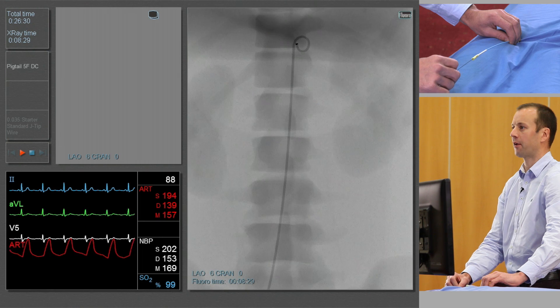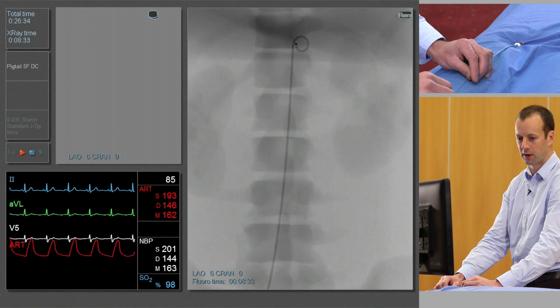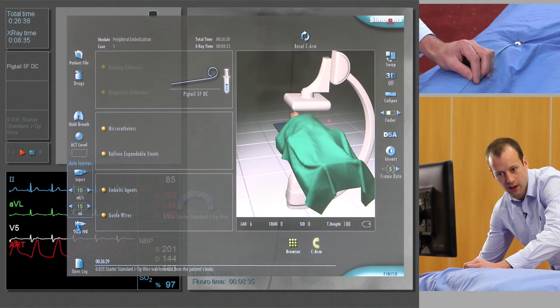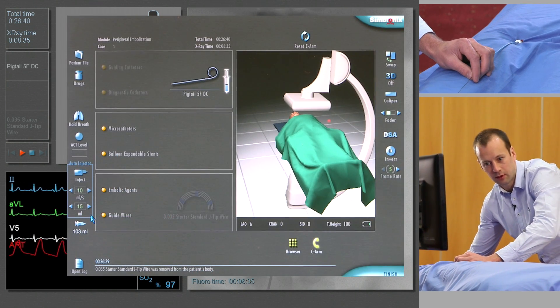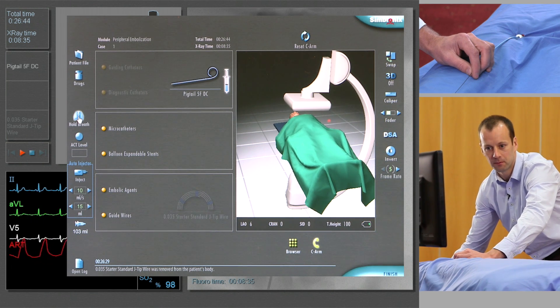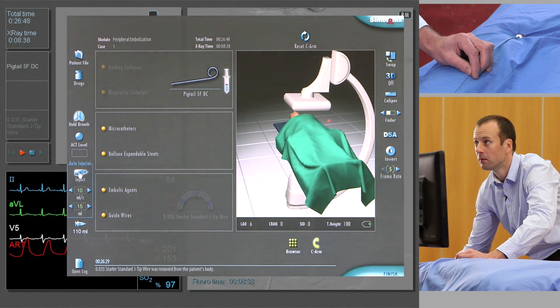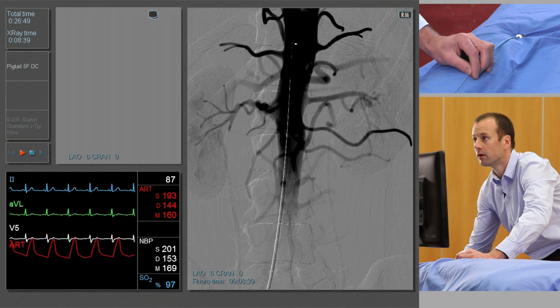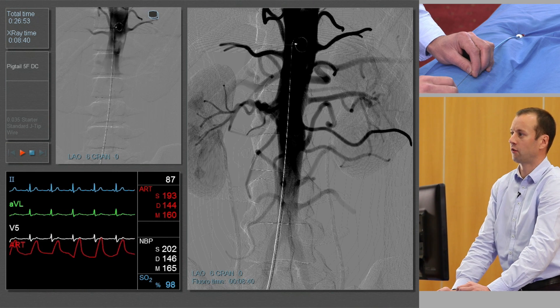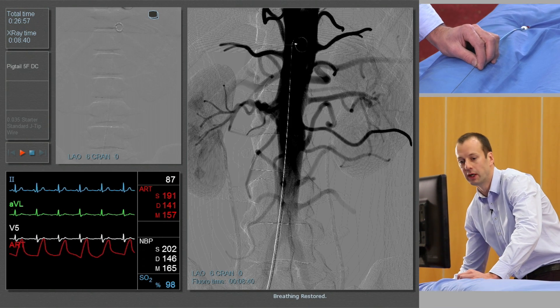We'll place the tip of the catheter at about T12 level, remove the guide wire, and we'll do a subtracted angiogram at 15 mils at 10 mils a second with a breath hold. Lovely. And we can see a clear view of the celiac and the superior mesenteric arteries, along with the renal arteries.